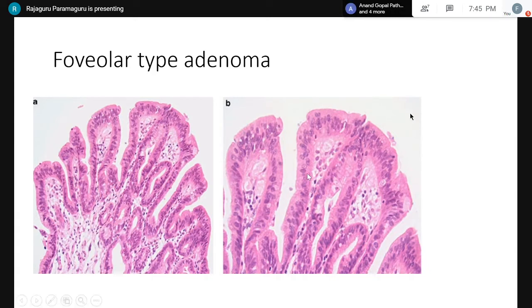They are going to be more rounded and show prominent nucleoli. The cell with which we can compare it is the lymphocyte in the lamina propria. They are usually 3 to 4 times the size of the lymphocyte in the lamina propria. If they are of that size, then we are dealing with something like a foveolar dysplasia.